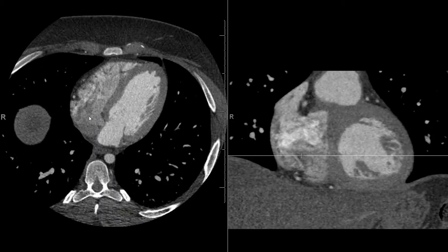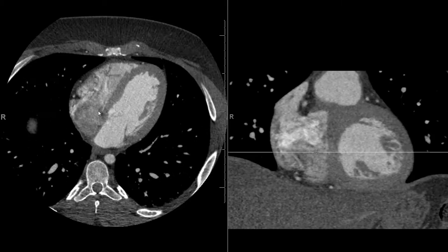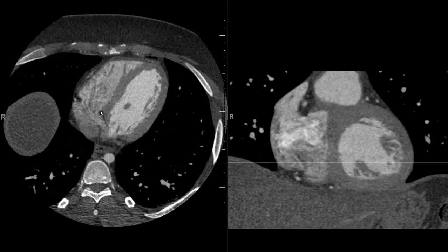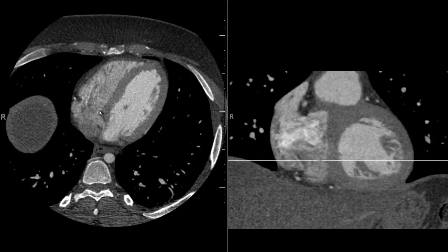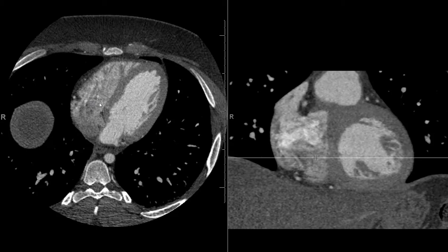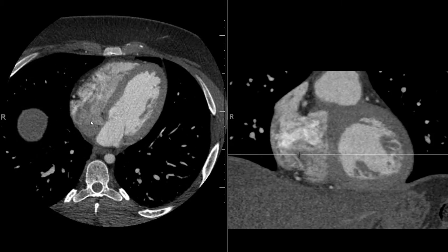From the right atrium, blood is going to pass through the tricuspid valve, which is in this region. The tricuspid valve itself is difficult to see because of motion on this particular scan, but it would separate the right atrium from the right ventricle. The right ventricle is a larger chamber located more anteriorly — the most anterior chamber of the heart — due to the oblique axis of the heart in the chest.